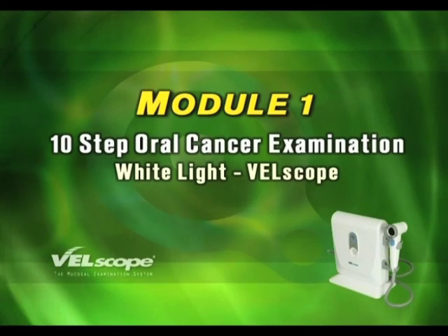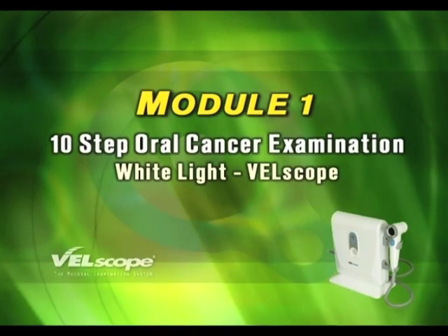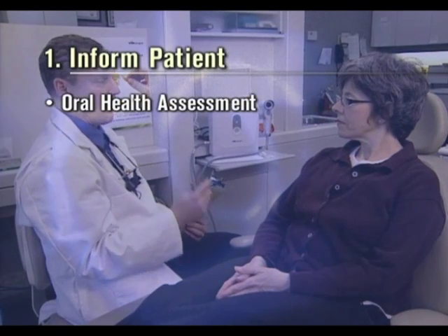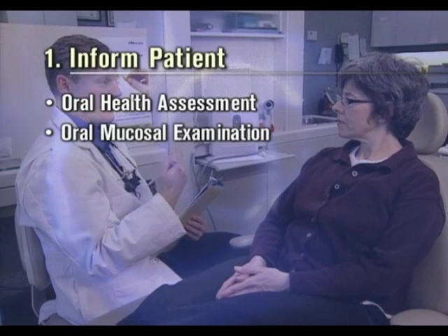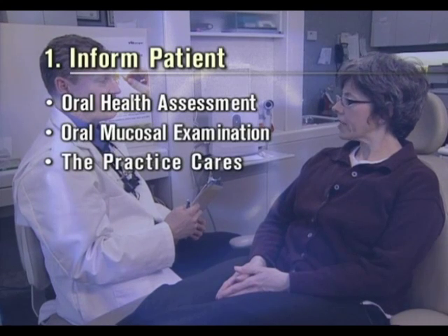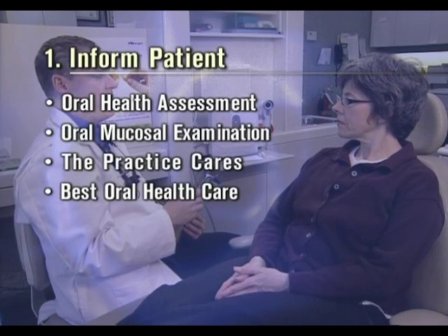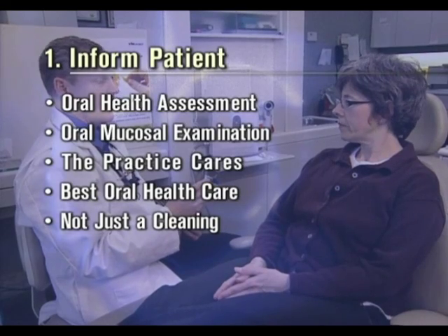Module 1 – The 10 Steps of a Thorough Oral Cancer Examination using White Light and Velscope. Inform patients that they are receiving a thorough oral health assessment, including a comprehensive oral mucosal examination. This shows that the practice cares about their well-being, informs the patients they are receiving the best possible overall oral health care, and demonstrates that this is not just a cleaning.